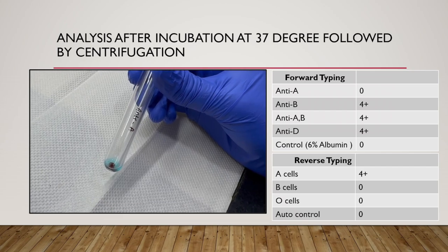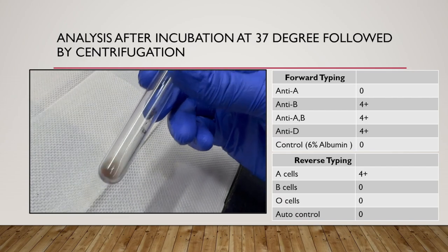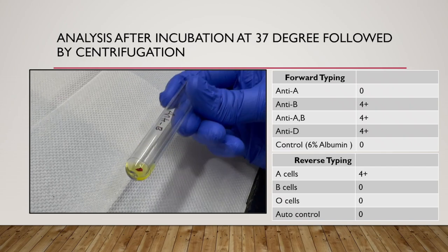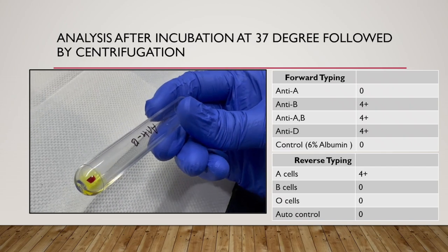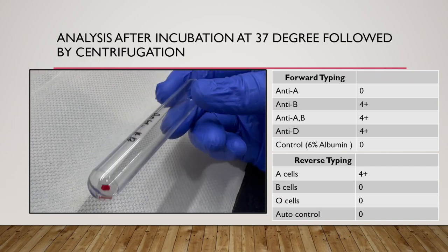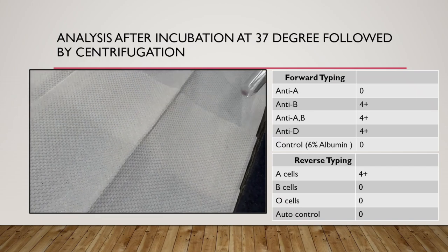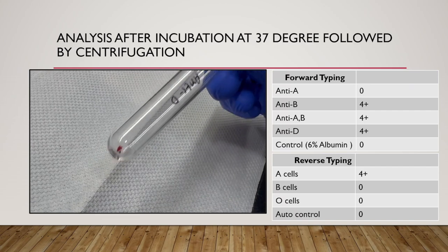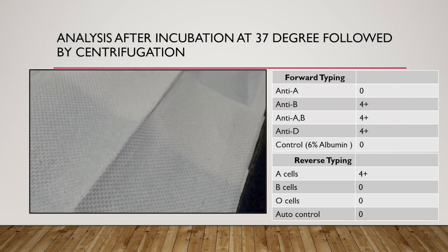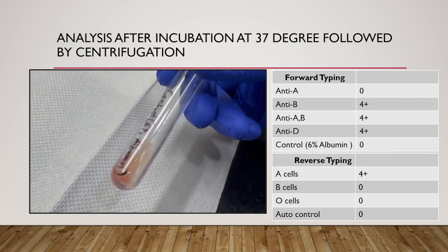Coming to forward grouping, in the tube of anti-A, on gently shaking the tube, there is no agglutination reaction. In anti-B, there is a strong 4 plus agglutination. In the tube of anti-AB also there is a strong 4 plus agglutination. Coming to anti-D, here also we can see a strong 4 plus agglutination reaction. Coming to the 6% control albumin tube, there is no agglutination here.